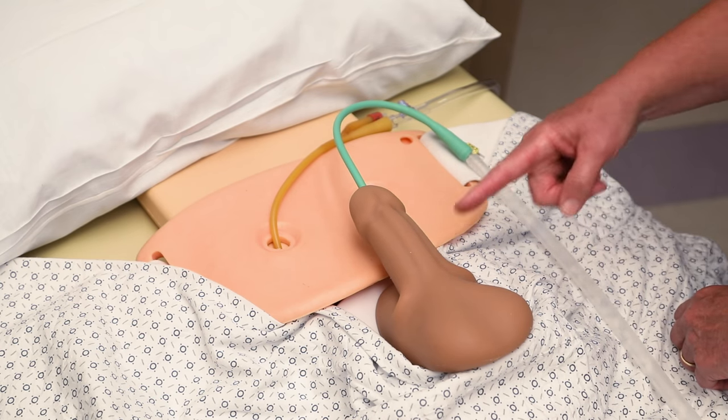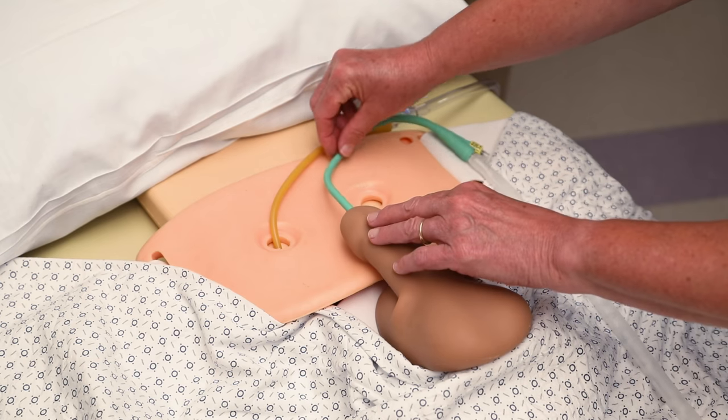If a urethroplasty was performed, the preferred location to anchor the catheter is on your abdomen.